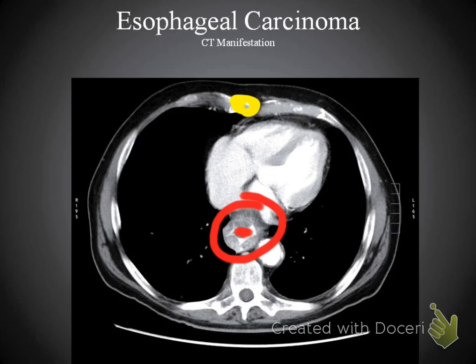If we had the capability to measure, we would see that this wall is probably around four millimeters or greater, and because of this it is very indicative of esophageal carcinoma.